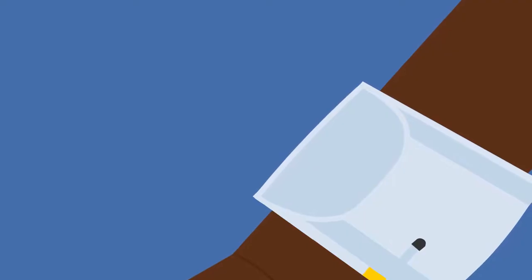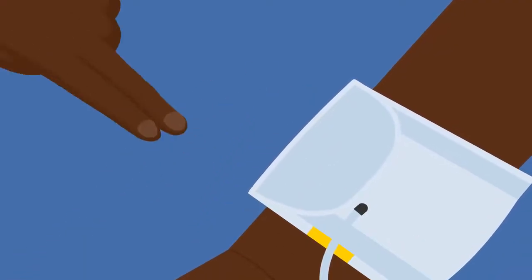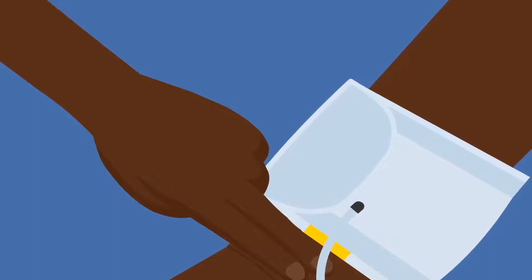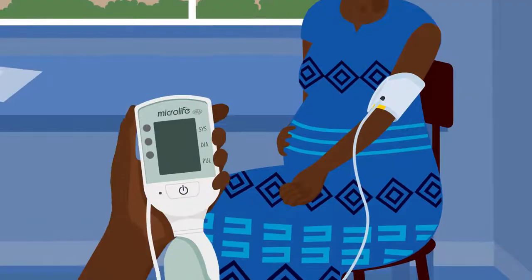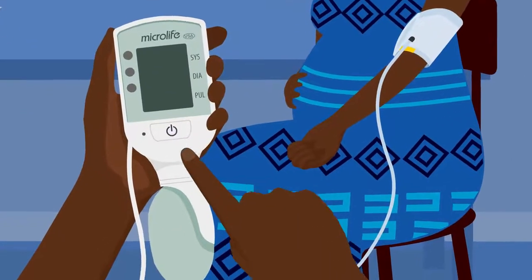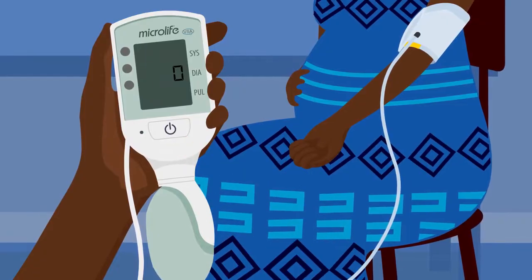Check that the yellow tab is above the woman's elbow crease. There should be a two-finger gap between the cuff and elbow. Press the ON button. Wait to hear a beep noise, and then the Cradle VSA is ready to use.